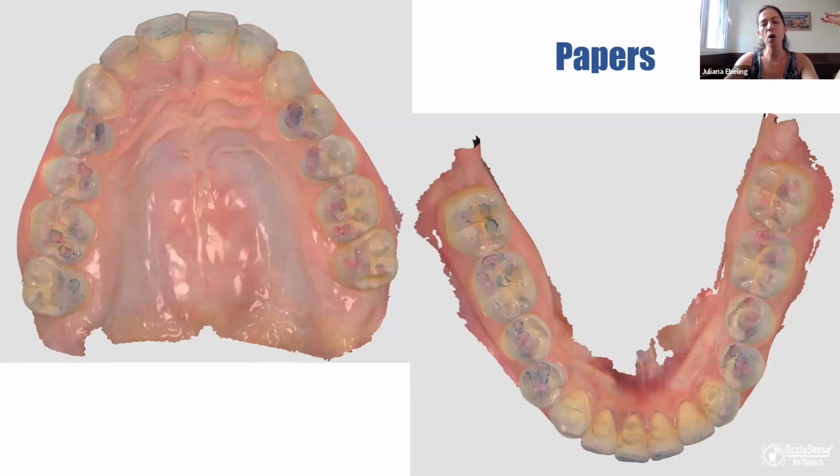And when we go to OccluSense, it works in a completely different way. If I don't understand this, I'm always trying to correlate what my brain was trained with to what I'm finding with OccluSense, and we need to change a little bit how we look at that data to understand what is happening. Okay.